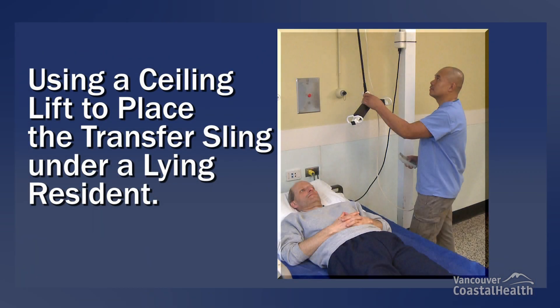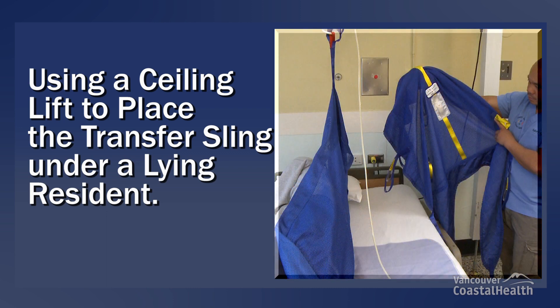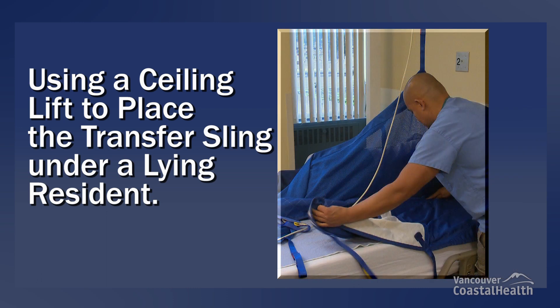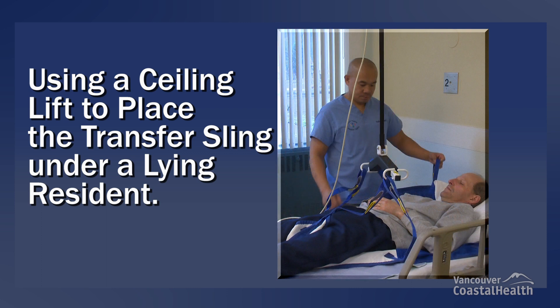Using a ceiling lift to place the transfer sling under a lying resident. It can be physically challenging to place a transfer sling under a resident who is lying in bed and requires more than minimal assistance to turn in bed. Using a ceiling lift to turn the resident in bed will enable the caregiver to place the transfer sling under the resident with very little physical exertion, therefore minimizing the risk of musculoskeletal injury for the caregiver.